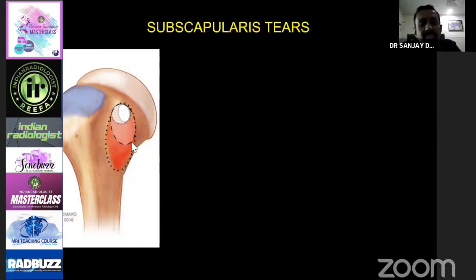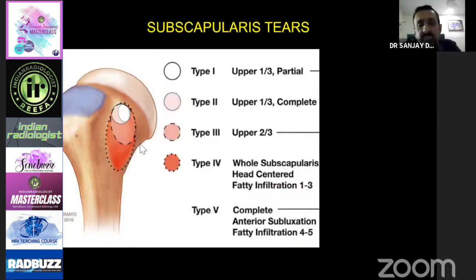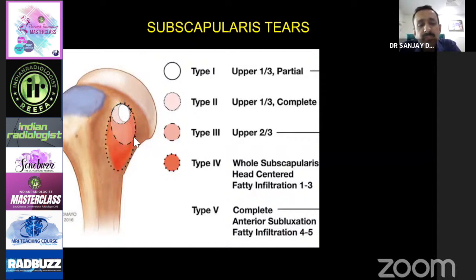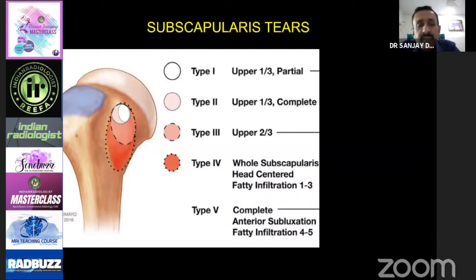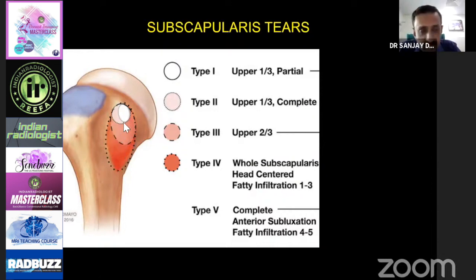For subscapularis tears, remember that the subscapularis inserts vertically from top to bottom along the lesser tuberosity. So you have tears involving the upper portion, mid portion, and the entire subscapularis. This has been classified by Lafosse as type 1 through type 5. Type 1 is upper one-third partial tear. Type 2 is upper one-third complete tear. Type 3 is upper two-thirds. Type 4 is the entire subscapularis with fatty infiltration grade 1 to 3, and more than grade 3 is type 5. Identifying the type is important because upper portion tears are associated with long head of biceps dislocation or subluxation, and different types have different treatments.